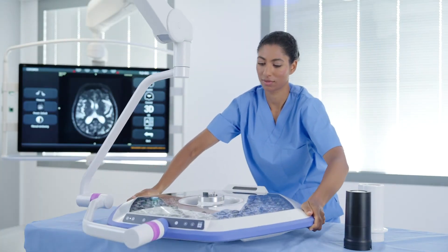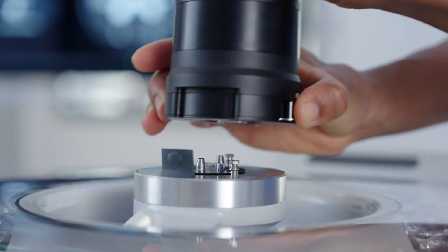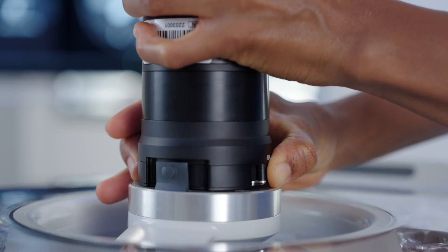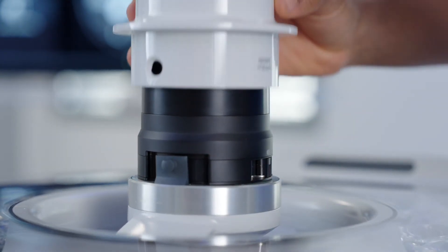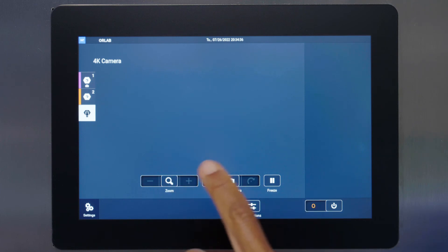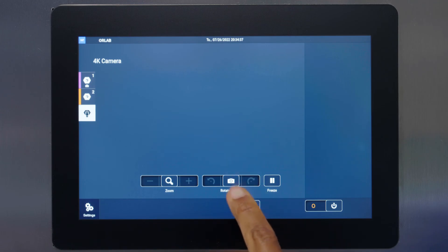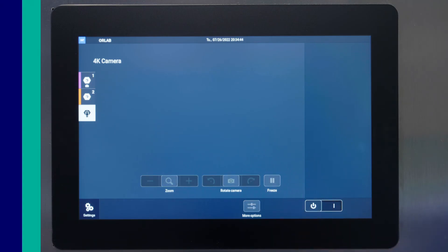To activate, attach the 4K camera to the Helix Pro light head. For the most control, flip the light head upside down to install. Add either a sterilizable or sterile camera handle. Select the camera icon in the quick access toolbar of your wall control to control the following functions: zoom in and out, rotate video clockwise and counterclockwise, freeze which pauses the camera, and power on and off.